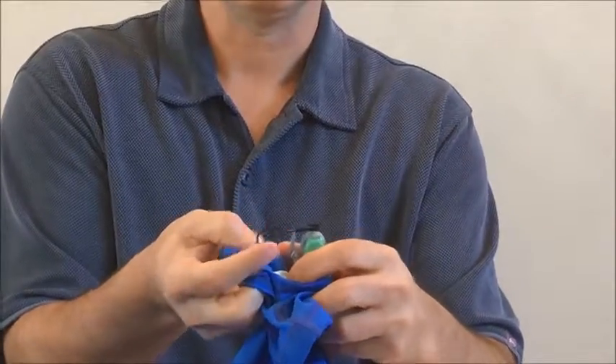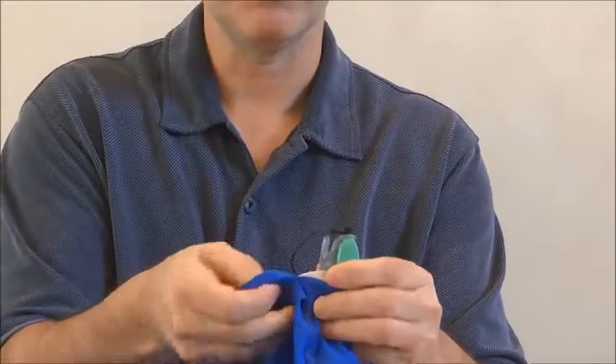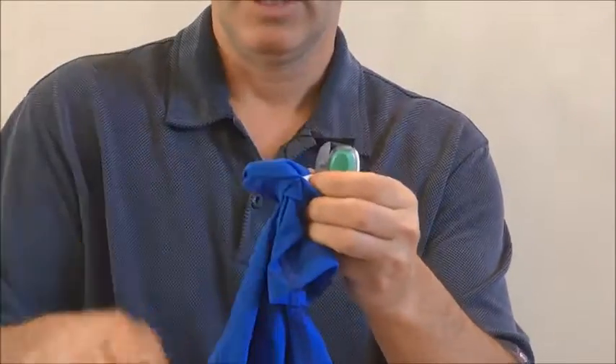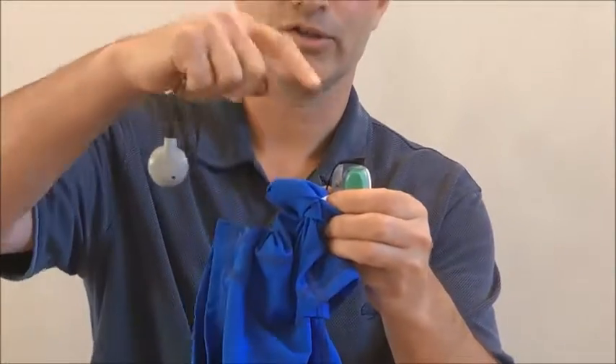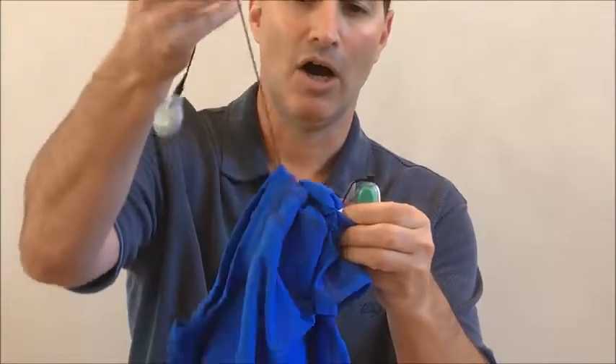This helps prevent the disconnection of this if the cord ever gets pulled from above. So let me demonstrate how this works. I'm going to pull this here and you'll see there's no pressure on this connection point as I yank on the cord.